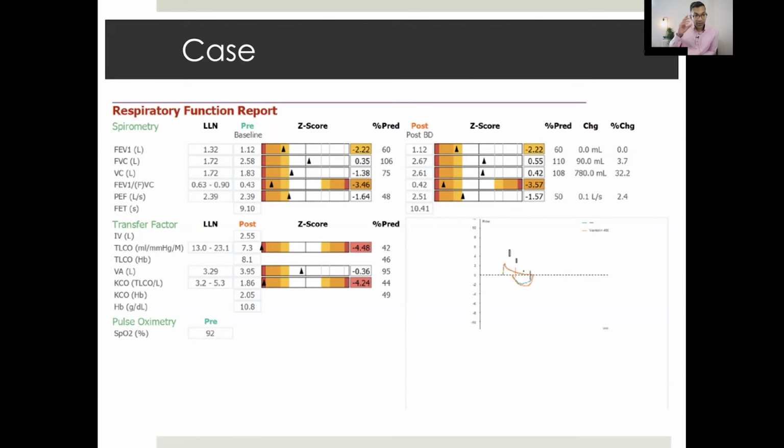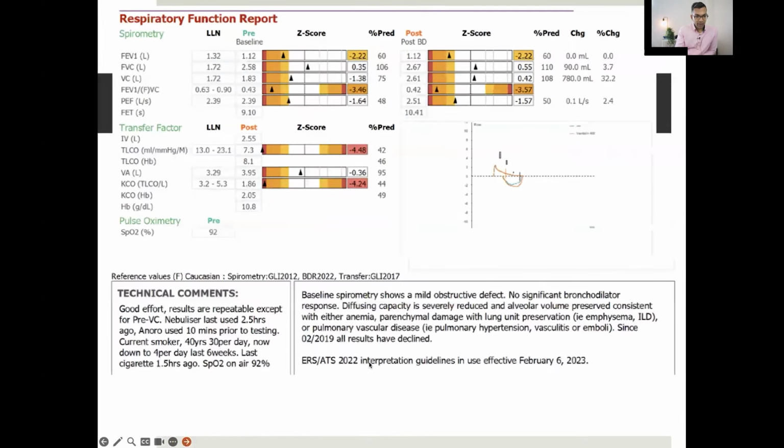Before you make any predictions, FEV1 was 60% predicted. It is some level of obstructive. You've now said it's moderate obstructive. What's the very next thing? Post-bronchodilator it's still 60, so it's got no bronchodilator response. So this is not asthma. I'm thinking of emphysematous COPD with the TLCO being low as well. Yeah, great. So this is probably emphysema.